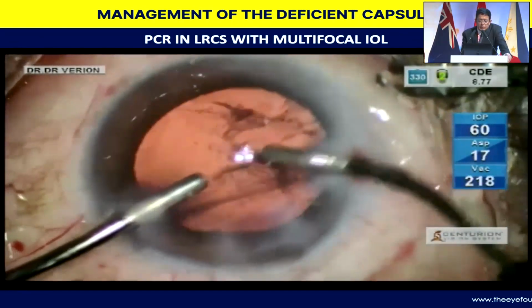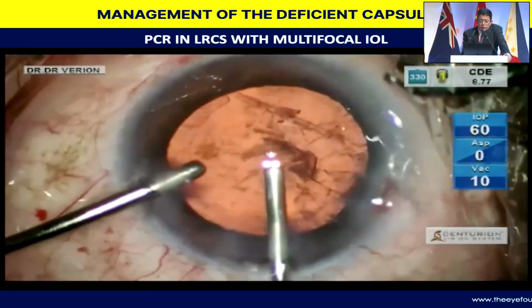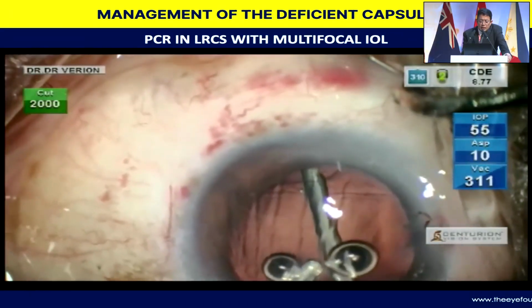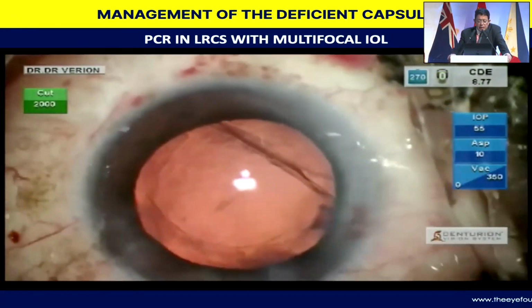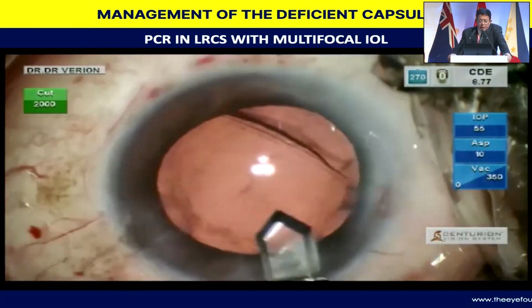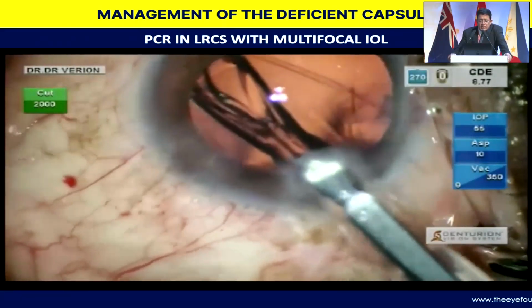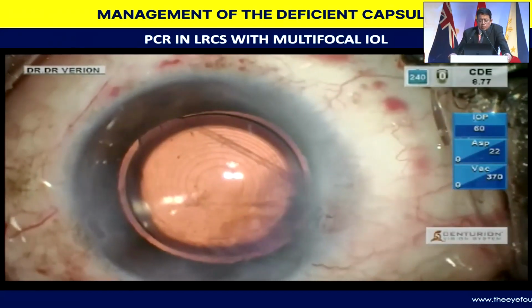And then you can see a small discontinuity at this 6 o'clock position, and this is the area of the PCR, but an adequate amount of posterior capsular support was available. Since the lady had already received a trifocal lens, a continuous range of vision lens, in the other eye, I go ahead and decide, and here I'm enlarging the incision so that I do not do a wound-assisted implantation, and I'm essentially directing the lens in the area where there's adequate capsular support. And in spite of this fairly large area of capsular defect, I'm able to implant a premium intraocular lens within the bag and get optimal results.